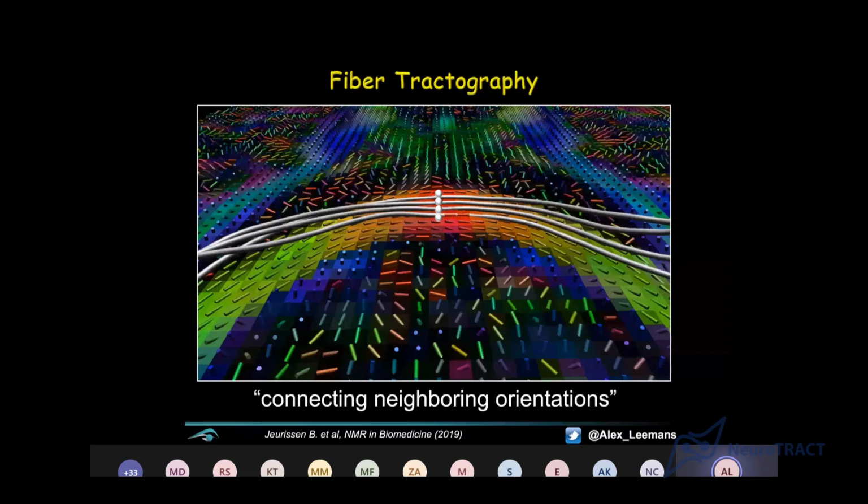You can follow the line of the water moving in the river. So we're doing something similar. We're just following the orientations, and we take a step, and it looks continuous now, right? Because in 3D, you take a little step, you look at where do I need to go now? Let's follow this dominant orientation of diffusion. And each time you take a little step. And when do you stop? Well, you stop, for instance, when at that location, the fractional anisotropy is low. So what does it mean?